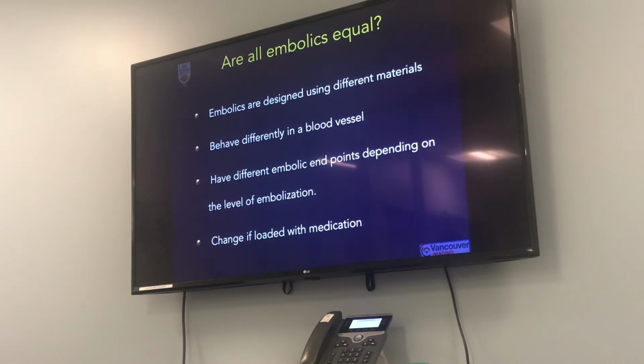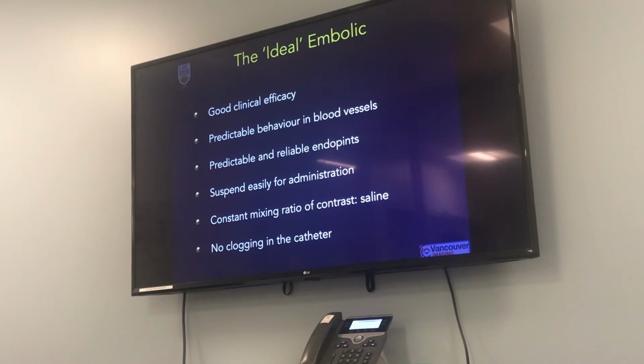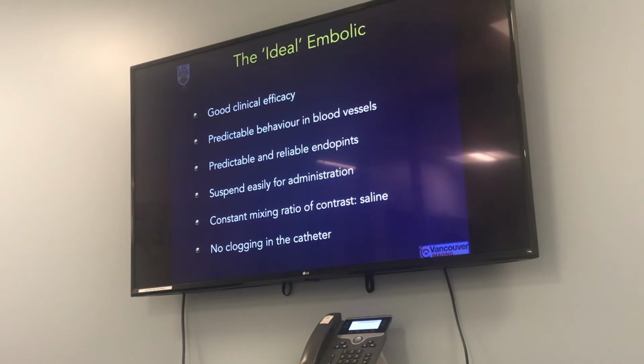And the size that we use is dependent on the plexus that supplies the fibroid. So we know the plexus supplying of fibroids has a certain vascular caliber, and those are the size particles that we inject. So all of the patients who have fibroids get the same size particles, except patients who have adenomyosis, which is a slightly different entity. It's where they have thickening of the endometrial stripes. It's a slightly different disease process that requires smaller particles, and I'll tell you why that's important.